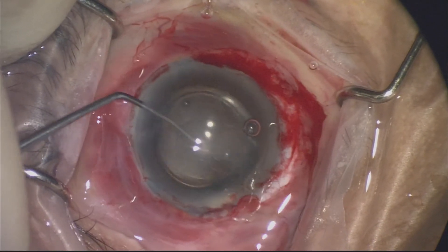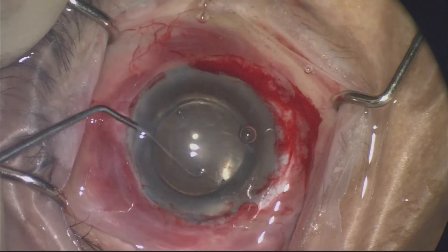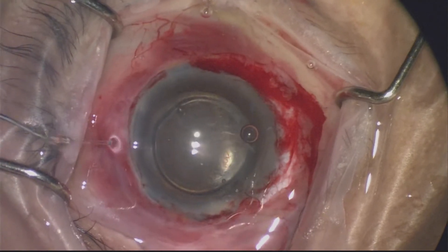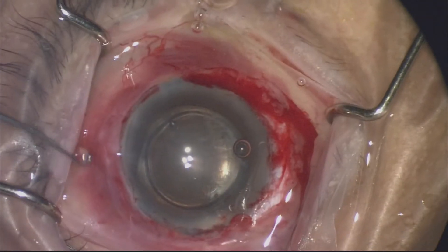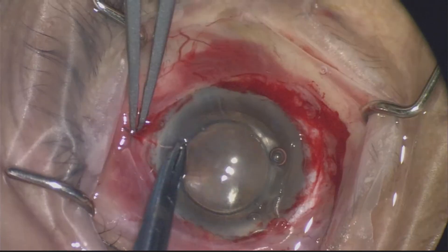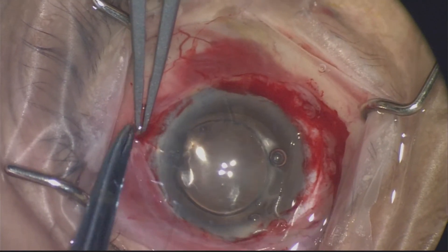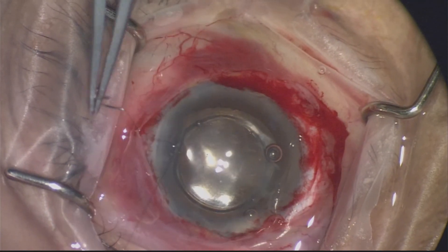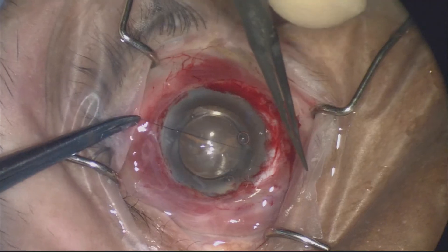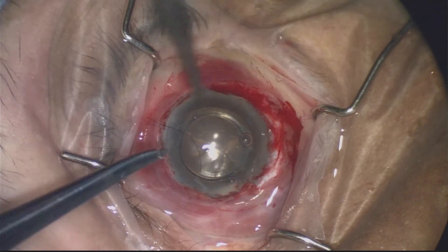I use a polish mode to remove the capsular remnants on the inside surface of the capsular bag. I make sure the position of the lens is adequate and that it's stable within the bag. Before doing the IA with bimanual, I make sure the wound is secure.